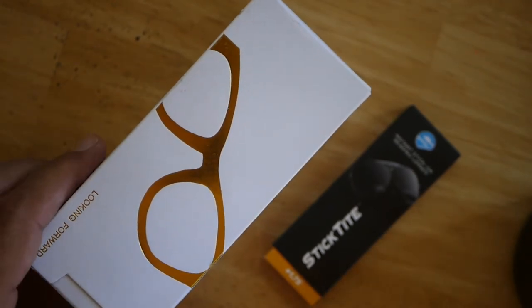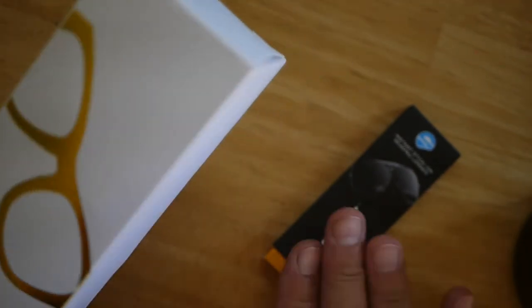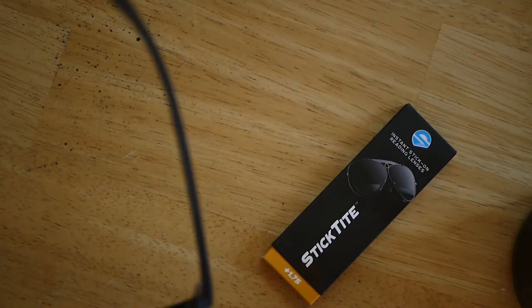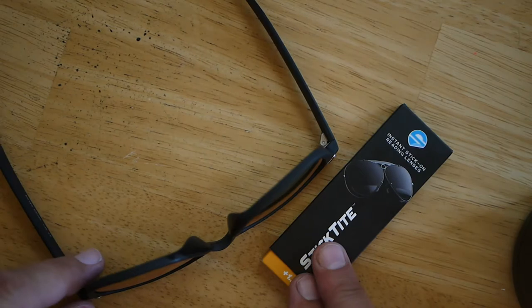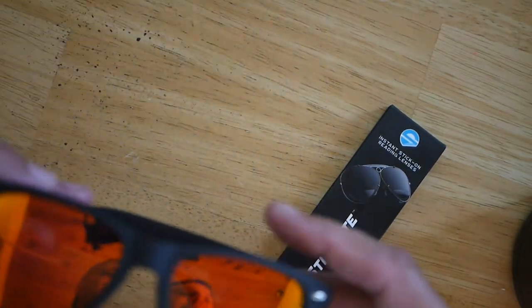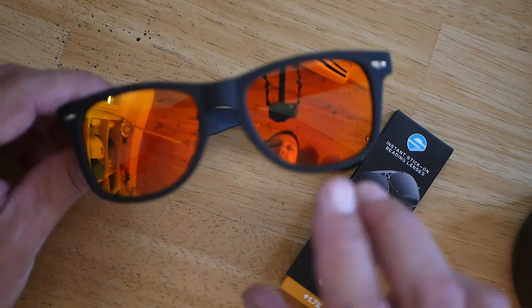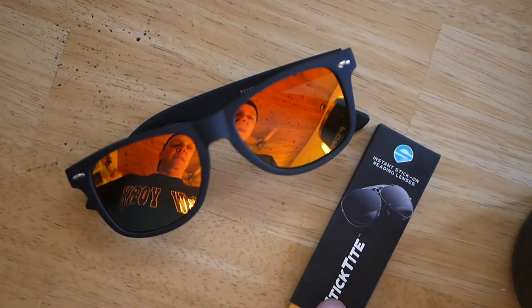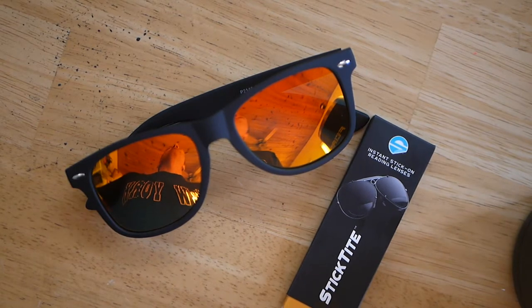Hey guys, welcome back. We've got a little different one today. I bought some sunglasses and I bought some stick-on bifocals — or I guess reading lenses, they call them. I'm an old man now, I've come to admit it. My eyes are definitely not what they used to be.